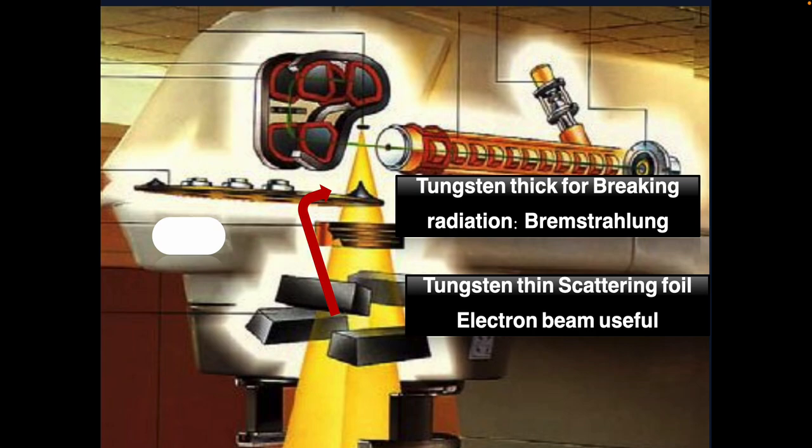The energy can be 6, 8, 12, 16, like even numbers. It can be 6, 9, 15, like odd numbers. You have to be aware, or orient yourself, whenever you go to a new department, what kind of energies and what the beam characteristics are for your electron beam.